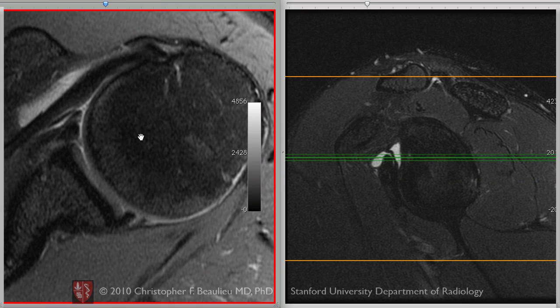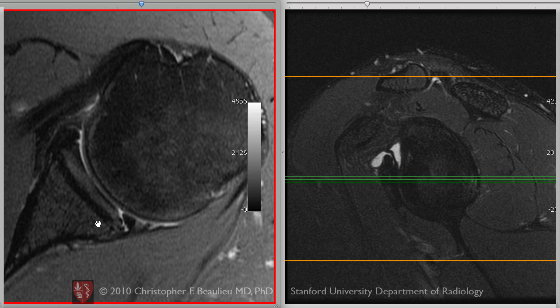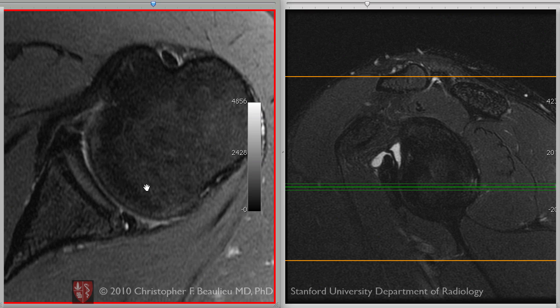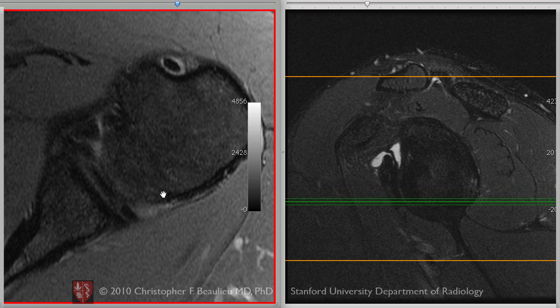Contrast that with the posterior labrum. Here we are in the mid-glenohumeral joint, articular cartilage. Here's the posterior labrum, and on one or two sections we see very bright signal intensity coursing through the labrum, through the base of the labrum, back towards the edge. And that's on several adjacent cuts, so the labrum triangular itself is relatively intact, but this structure is detached at this point.